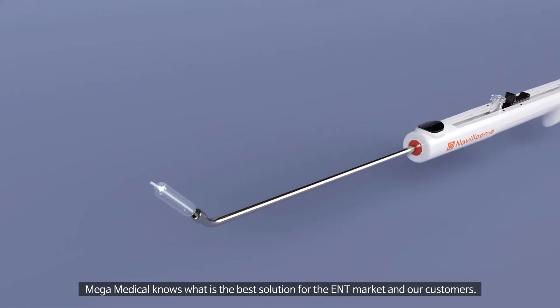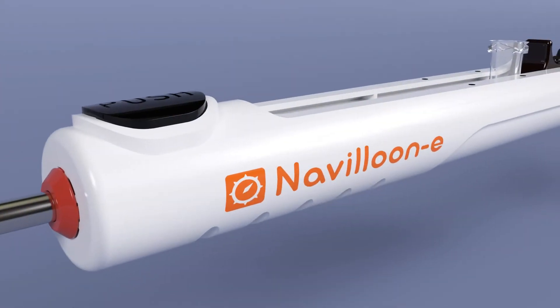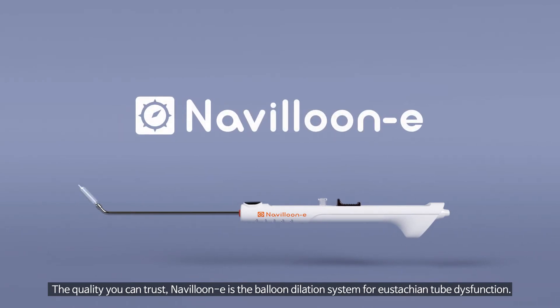Mega Medical knows what is the best solution for the ENT market and our customers. The quality you can trust. Navilloon-e is the balloon dilation system for Eustachian tube dysfunction.